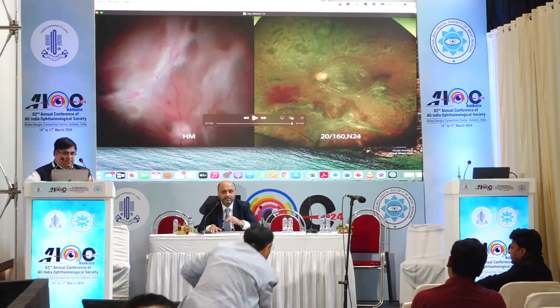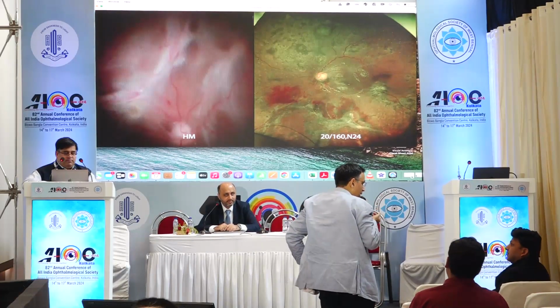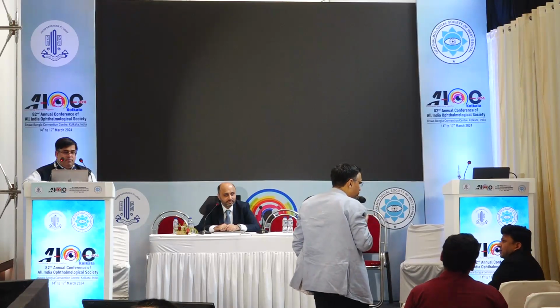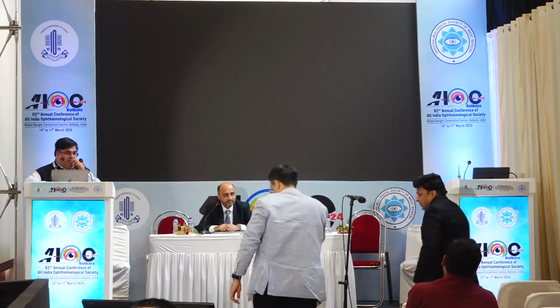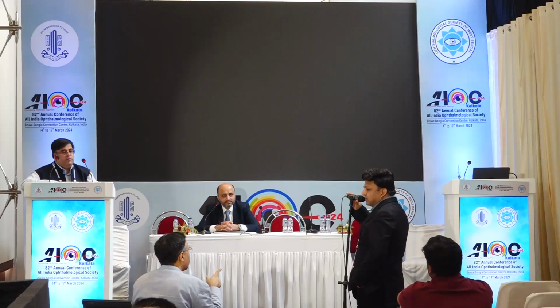Any role of interface vitrectomy, Dr. Sangeet? Do you ever switch to air if you have a lot of bleeds intraoperatively? Yeah, if blood disperses in the vitreous cavity and keeps on bleeding, what I generally do is switch the patient to air, and you see the view becomes better when you switch to air. And you limit the blood to one place, stop it there, and then you can evacuate. Yes, yes. Two things. Yeah, please.